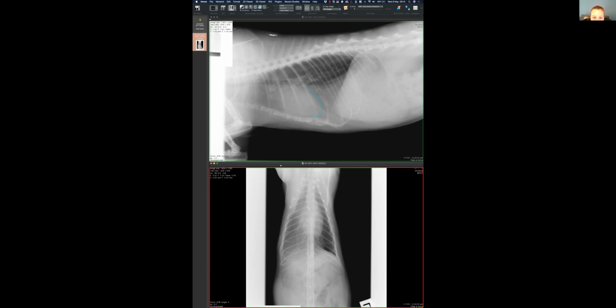And on the right cranial thorax. I missed that last part. So in terms of the diaphragm, you're saying that it looks flat. And what was the other comment? It looks like it's gone quite far back. Okay, so sort of T13, L1. I can also see soft tissue opacity on the right cranial chest, I think it's right because there's no markers, consistent with a small pleural effusion. Can you show me that? Okay, good. Yeah, that's what I've got.